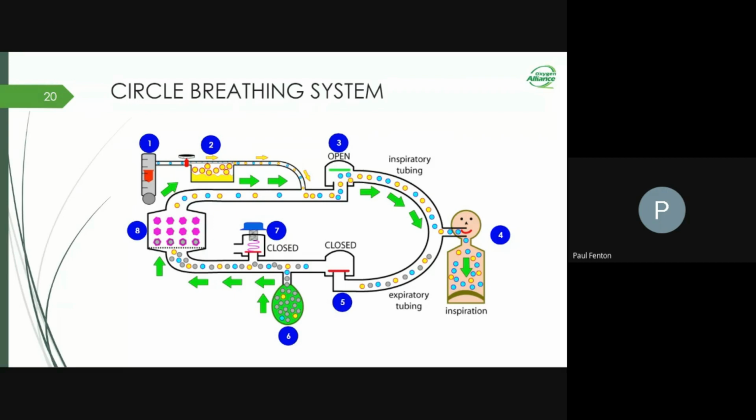It's a long story going back a long way, Jerry, but the very first prototype in the late 90s for the forerunner of the UAM did have a CO2 remover. It didn't work out very well, and there was a problem with renewing the agent all the time. And I was trying to get manufacture in the UK, and to keep it simple, we didn't have any kind of recycling of expired gases. It was to be a Mark II project that I wanted to get on the road, but it never happened.